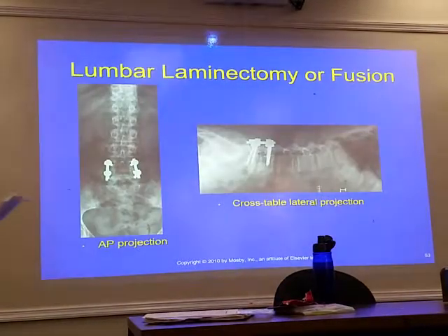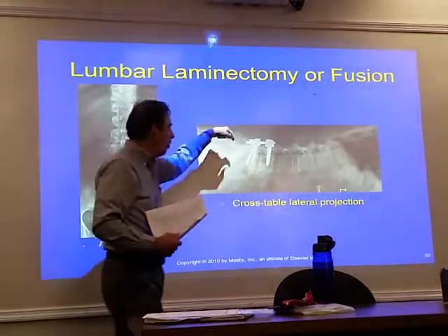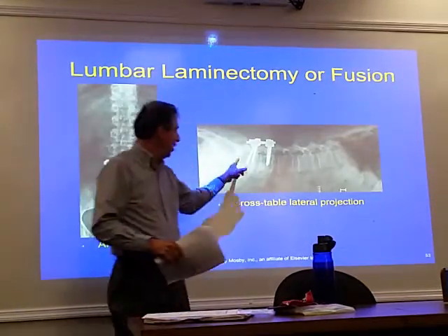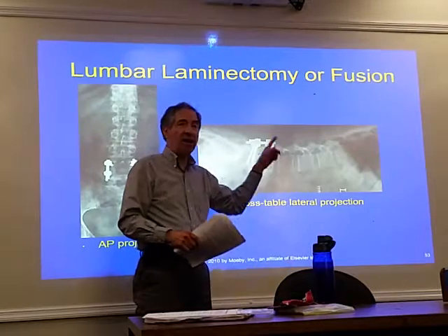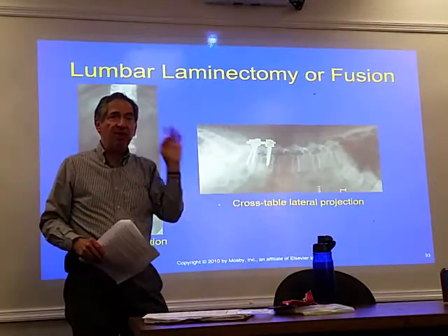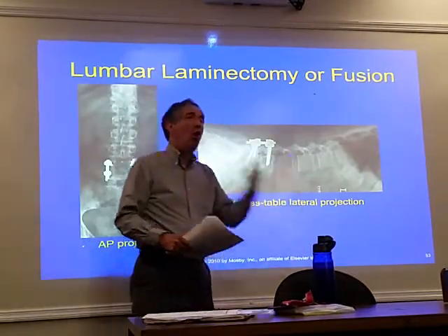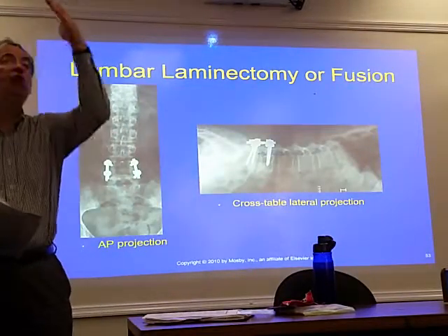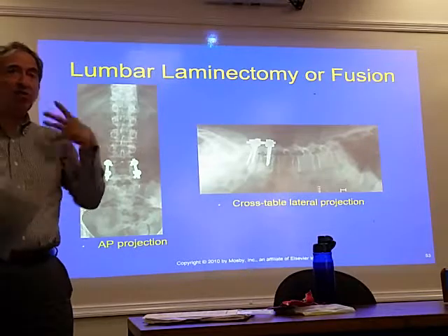A lot of times what you do when you do a scout, they'll put a needle in there and they'll ask you to go ahead and position. You need to be able to include at least one end, like they need to be able to see the L5-S1 region so they can count up. Or if you're doing cervical, you always have to include at least C1 or C2 to be able to count down. That's what you're doing it for.